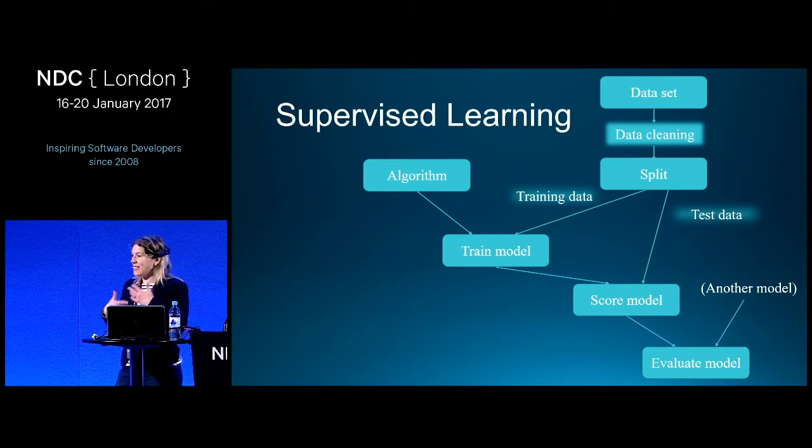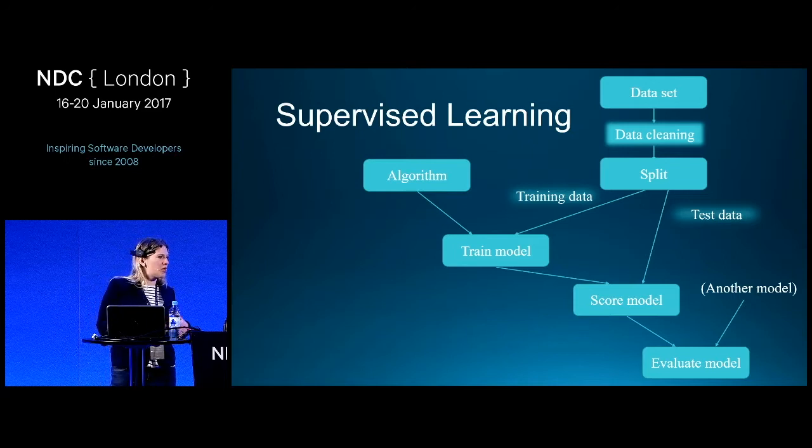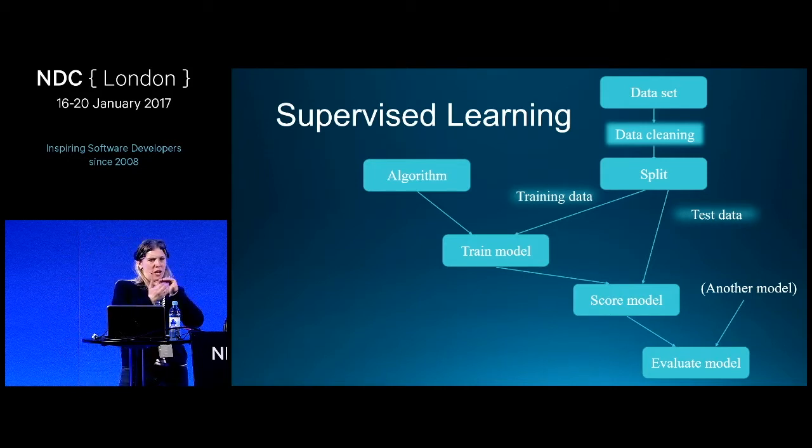And then you can apply various data cleaning modules. There's a whole bunch of different data cleaning modules to do things like handle data with missing values. How do you want to handle those? Doing filtering and other cleanup, like getting rid of the data with bad signal quality. If you saw those zeros in some of the contact quality, throwing that data out, all of those types of things, splicing out everything between the one and two, you could use a little script to do that. So all kinds of good stuff.